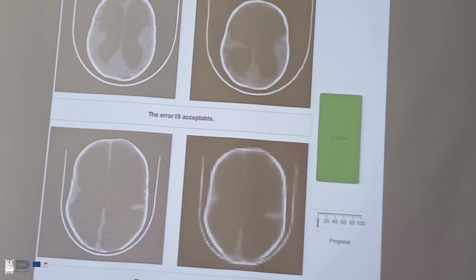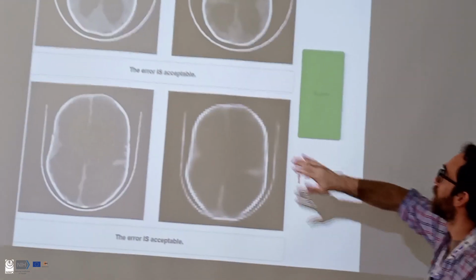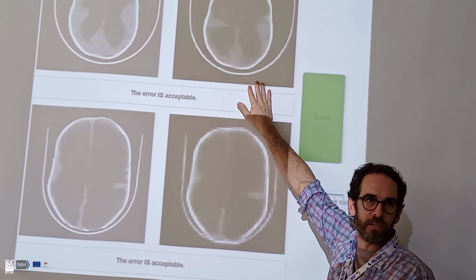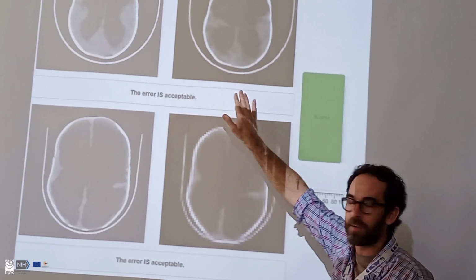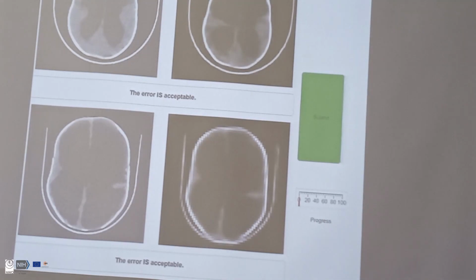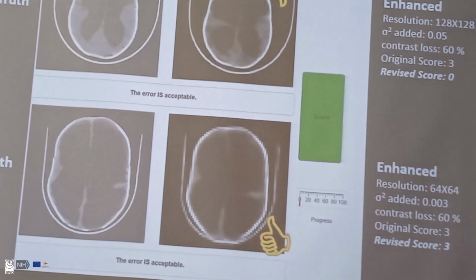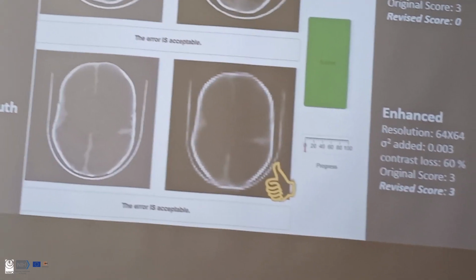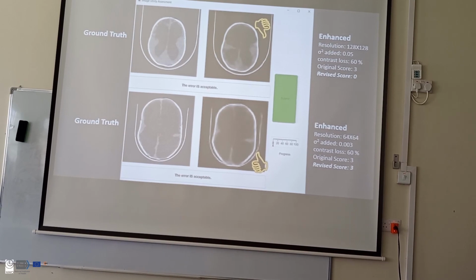Yeah. So, for example, if you had a decent image to do your surgery, and then you ended up with this one, 6 months post-surgery, maybe you think you need to go revise the shunt because you're starting to build pressure on one side of the brain, when in fact you're not, right? So this is an error that I think, I hope now that we've spent so much time, I hope that the surgeons also said they didn't like that. Yeah, they did, good. So this is an error that can create a new surgery for this kid unnecessarily, right? So this is a risk.